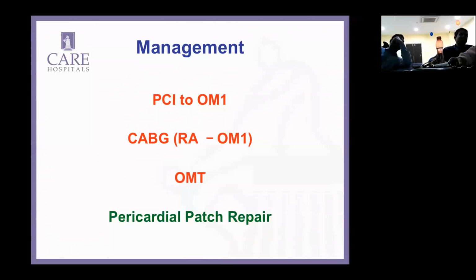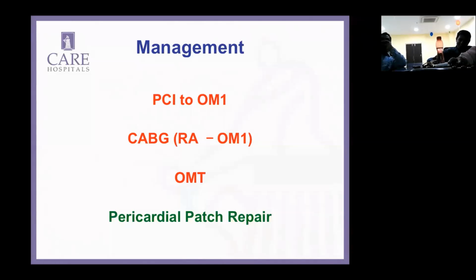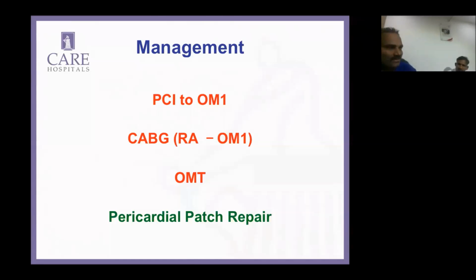Sharath? Yeah. Why do you want to tap that patient after 3 months if there is no tamponade anyway? I'll show you the echoes. The effusion was massive. Massive effusion, but there is no tamponade. Again, it is very unlikely in an acute situation, such a massive effusion without much tamponade. Was he kept on any other medicines like colchicine? Anyway, post-MI pericarditis. No, I have not used any medicine for him. Right. It is clearly a perforation. It is not pericarditis.